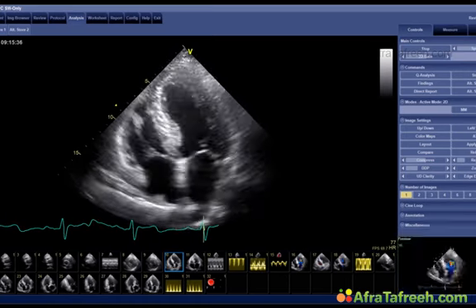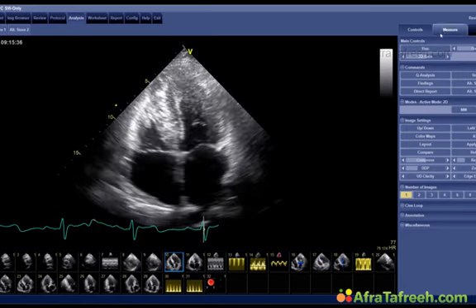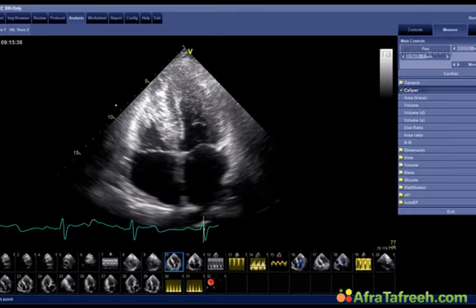The left atrium, I can maybe give you just a measurement of that to give you a bit of a feeling for the sizes of the heart chambers. 56 in this diameter, and the diagonal diameter would be 41. So it's mild to moderately enlarged.